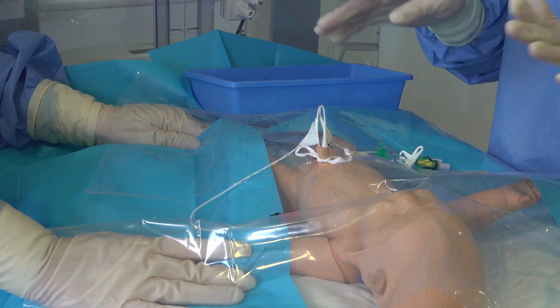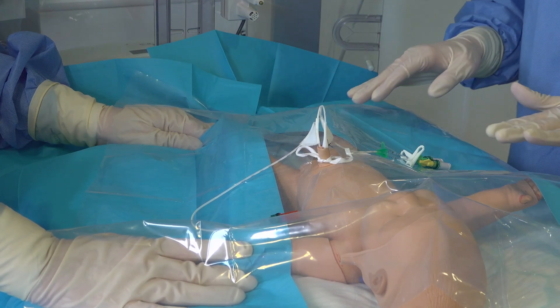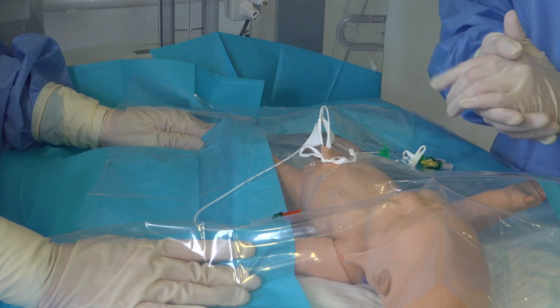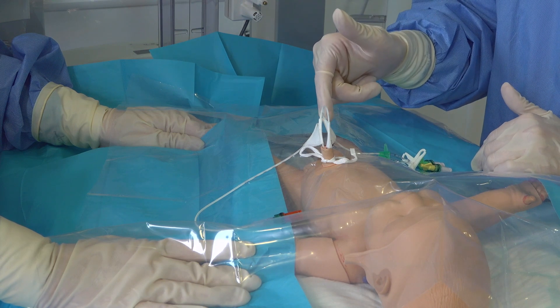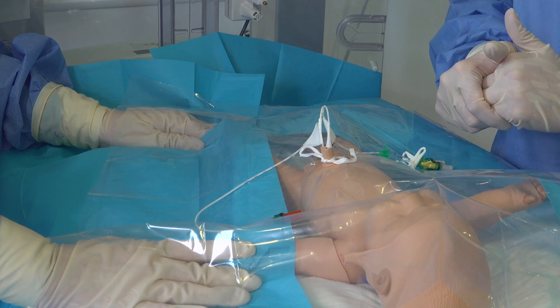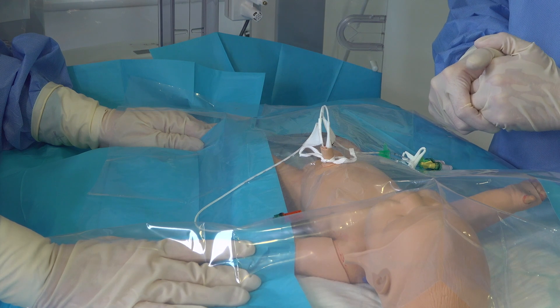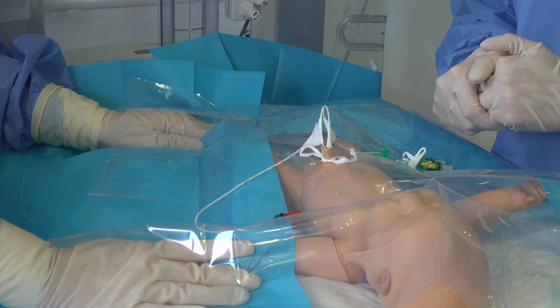Once we've done this we're going to remove our sterile drapes. Having inserted the line, I'm going to put the labels on my UAC and UVC. I will then request an X-ray to confirm position of the umbilical lines — that would be an abdomen and chest X-ray. Following this I would then complete the central line insertion checklist.